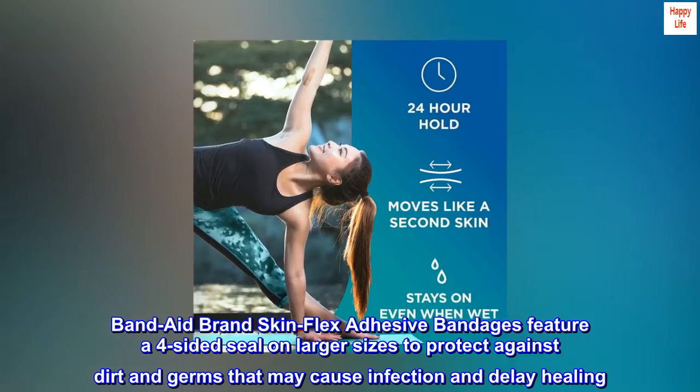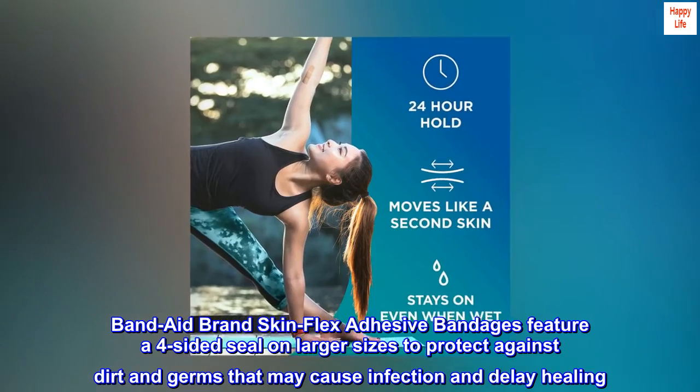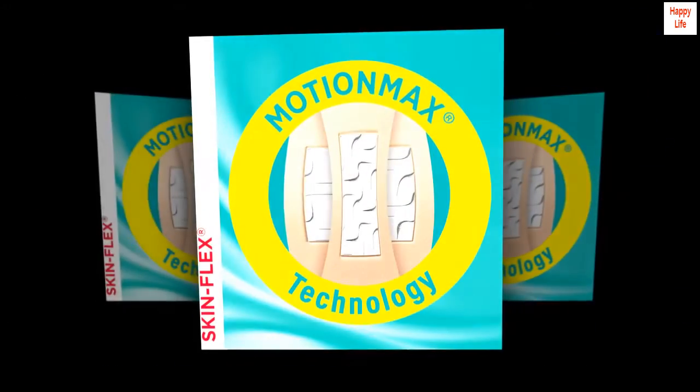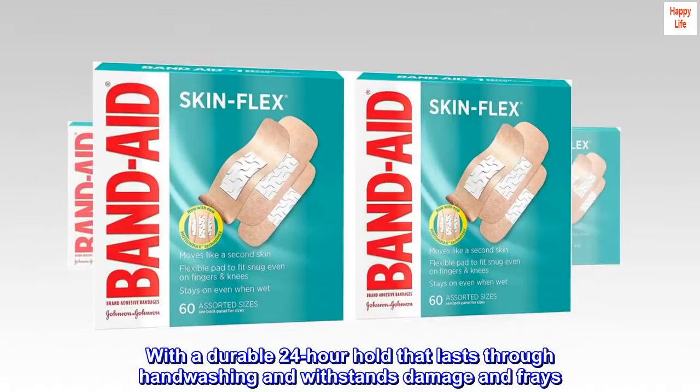Band-Aid brand skin flex adhesive bandages feature a four-sided seal on larger sizes to protect against dirt and germs that may cause infection and delay healing, with a durable 24-hour hold that lasts through handwashing and withstands damage and frays.